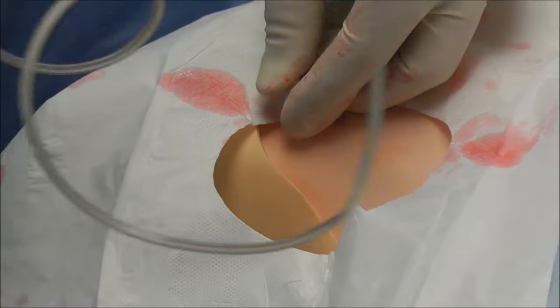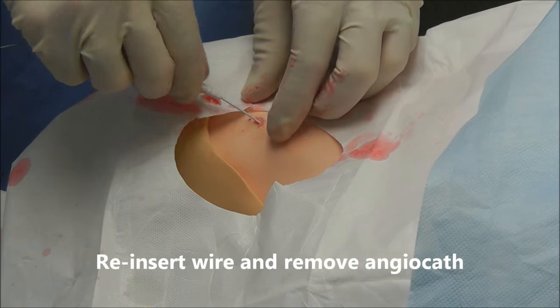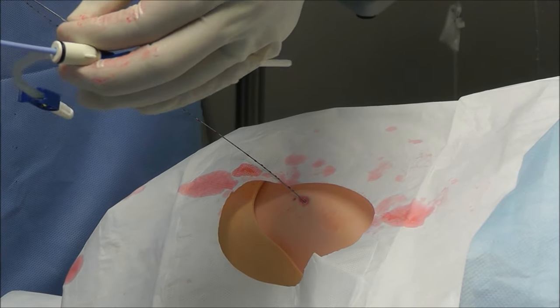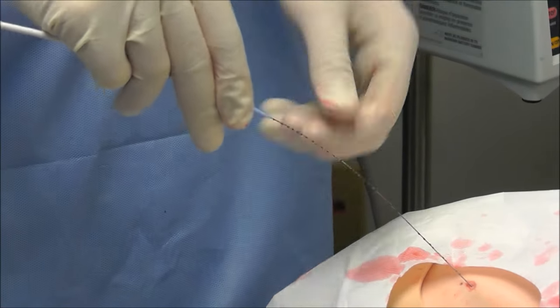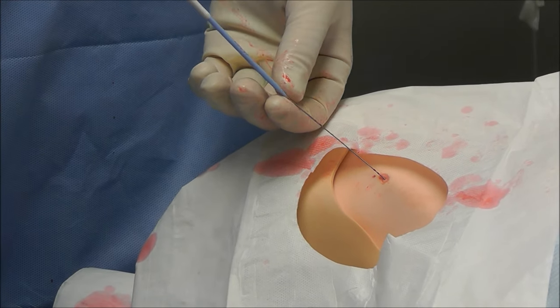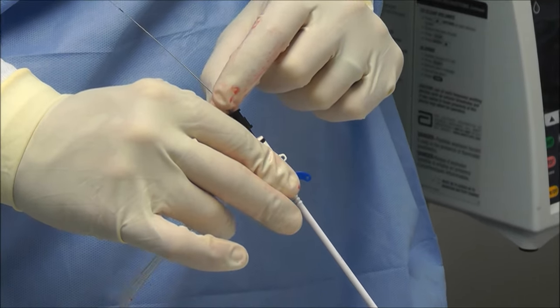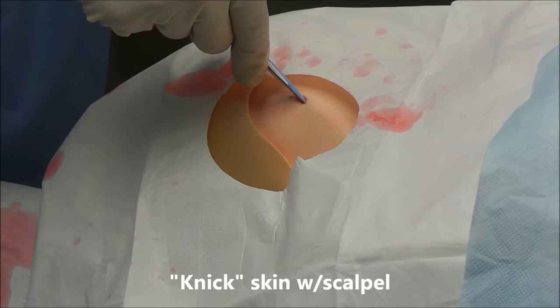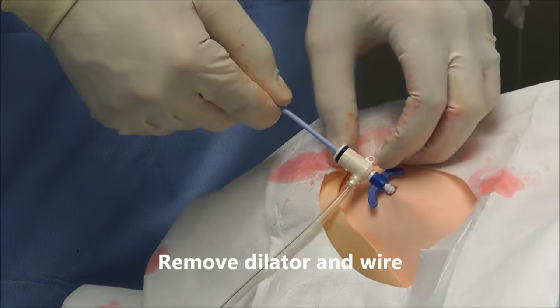I can now take this off. Now that the wire is back in, it's time to float our central catheter. I'm going to load my cortis here with the dilator. When it gets to right here, there are a couple of points I want to make. Number one: you should never insert this central line until you've grabbed the wire on the opposite side. Number two: this is going to meet a lot of resistance at the skin, so you're going to need to make a small nick with the scalpel.